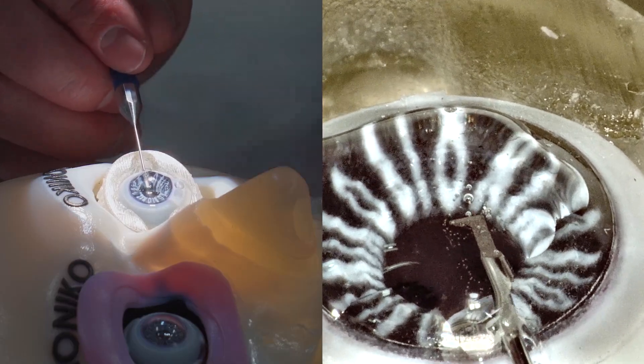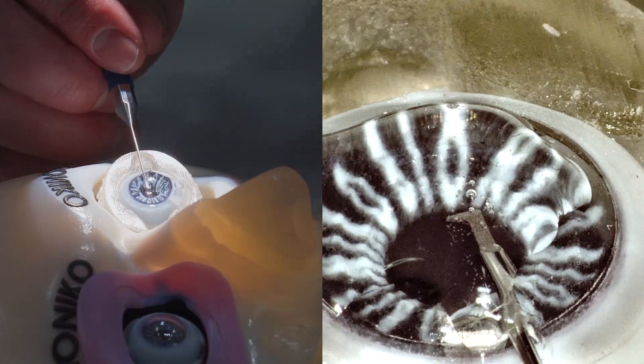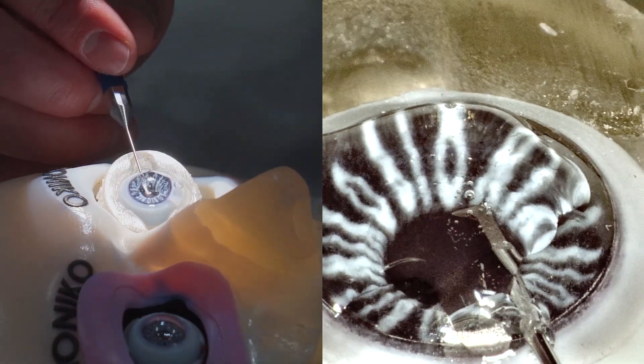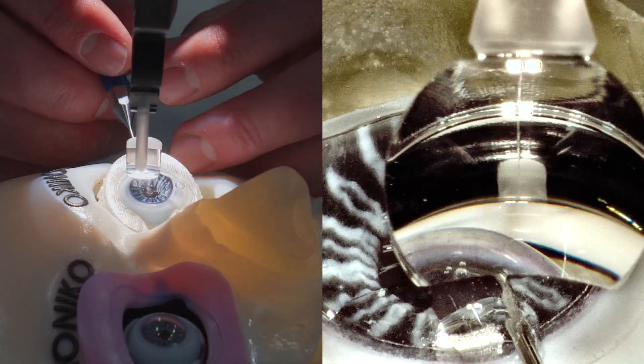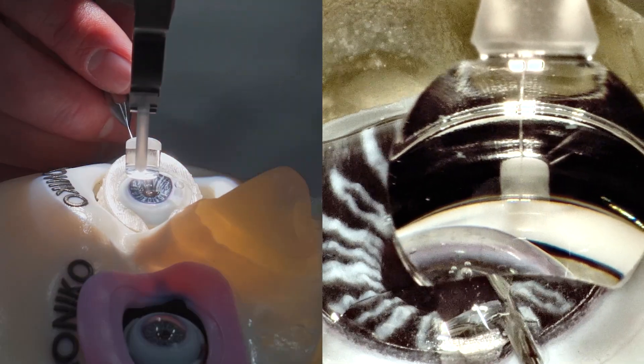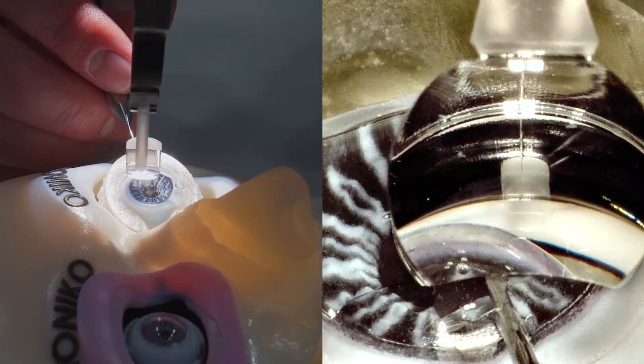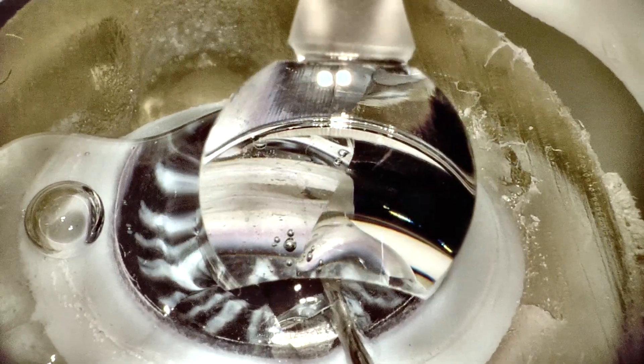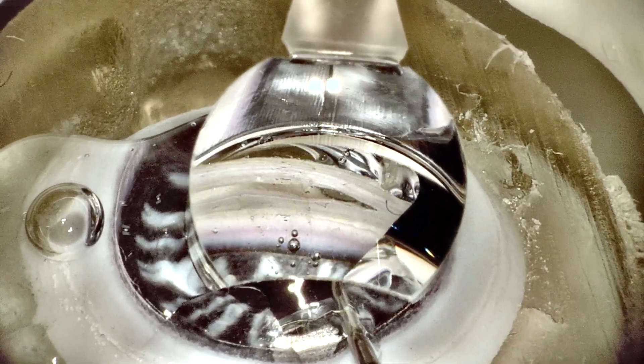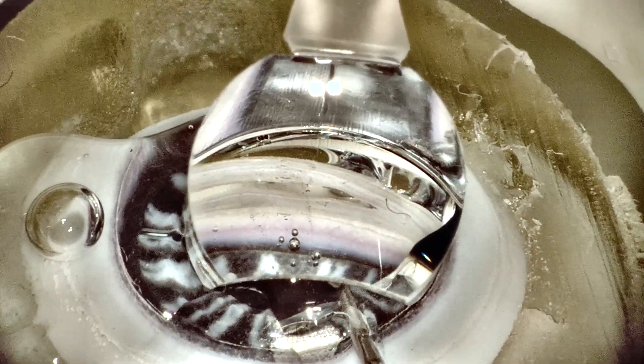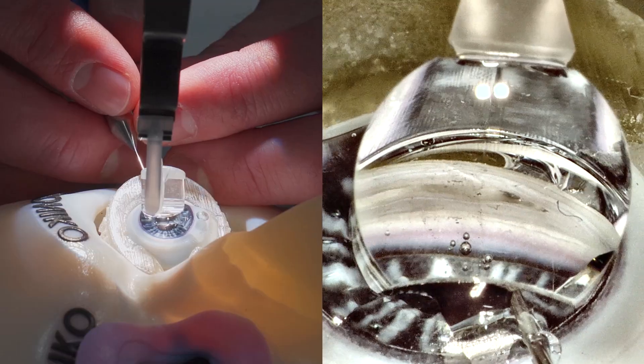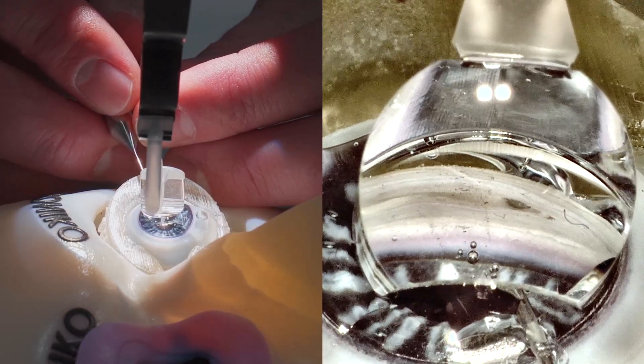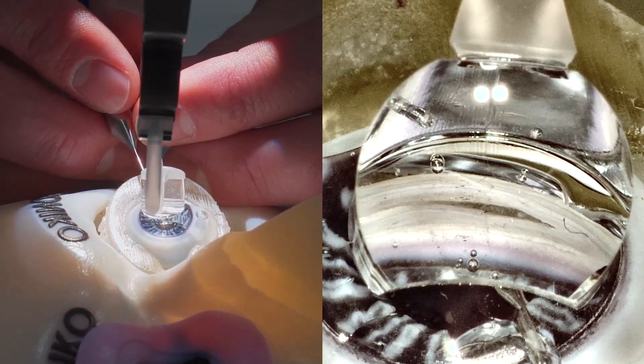Once we get about halfway across to mid-pupil, we're going to grab the blue handle, swing our gonio ready into position, and then with the blue dial we're going to slowly dial this down onto the cornea until you get a nice seal of that viscoelastic. You can see the view that we get, which is pretty well in focus. Again, that pre-focusing initially puts us in pretty good position.